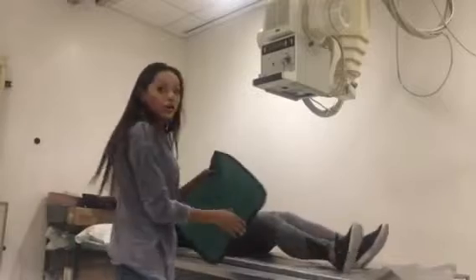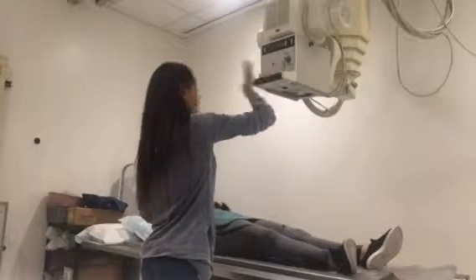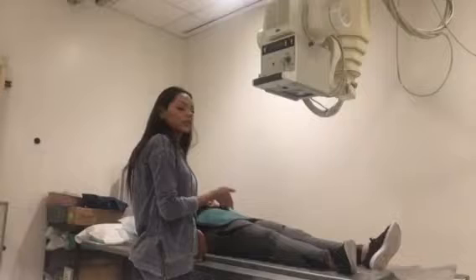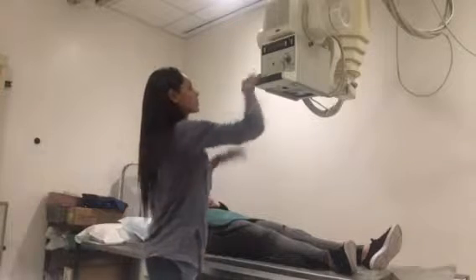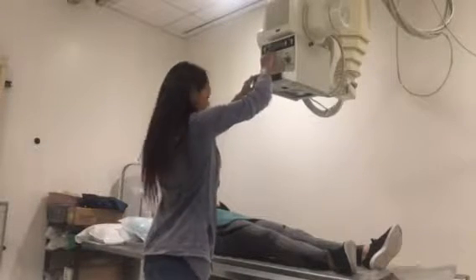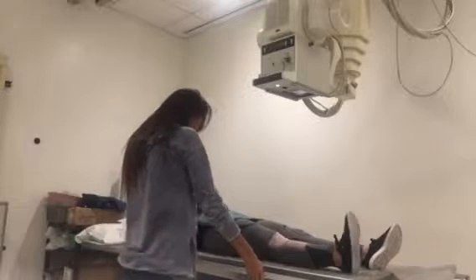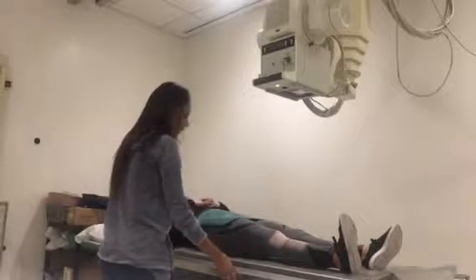Okay, so then I'm going to go ahead and show my patient. And then for my AP, my central ray is going to be perpendicular. The angulation varies depending on the patient's size. So for her, I'm going to have it perpendicular. And I'm going to come in half an inch below the apex of the patella.